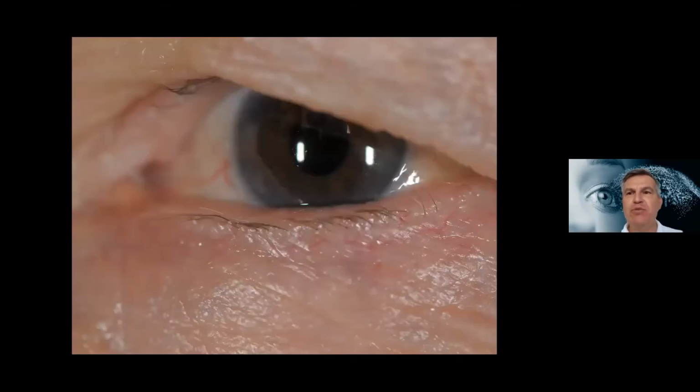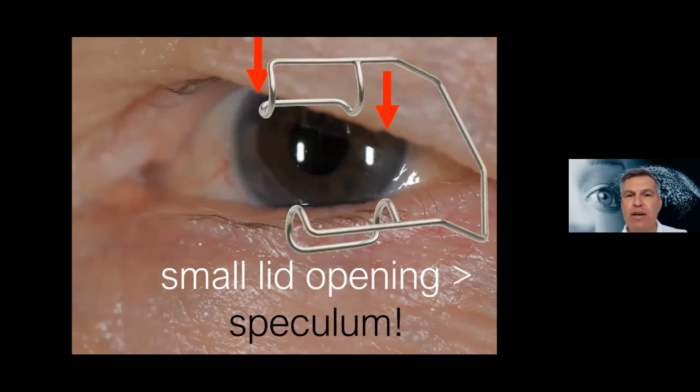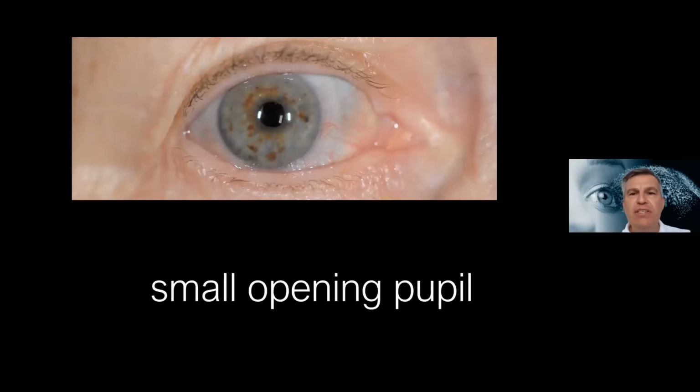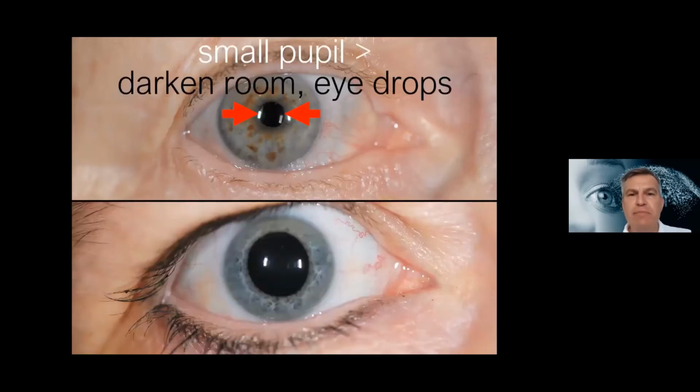This patient was really difficult to image because he has a very small lid opening, and then you can use a speculum to open the eyes. I prefer these ones because the eyelashes are also separated from the opening. Look here. A small pupil is really hard to get images of the retina or signals. So here you can darken the room or widen the pupil with eye drops.